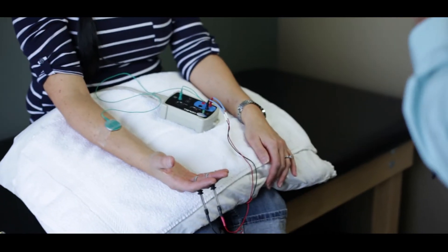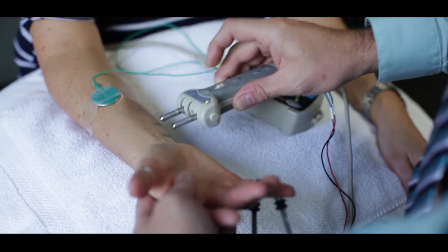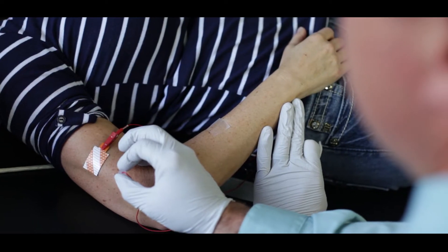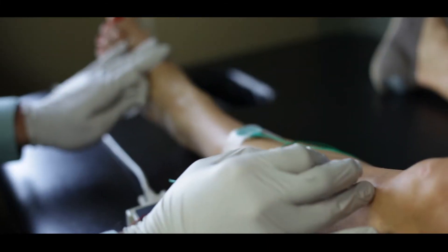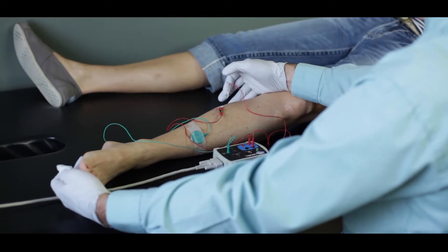Electrodiagnostic testing is a rather safe procedure. There is some discomfort associated with testing. We utilize electricity through a handheld stimulator to activate peripheral nerves and measure the responses, but not to a level that is harmful. The needle electrodes that we use are one-time use and they're sterilized, but there may be some discomfort associated with the placement of the needle depending on the location or the muscle that we test.